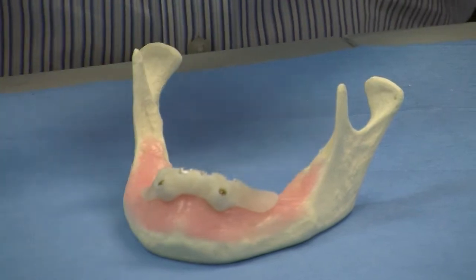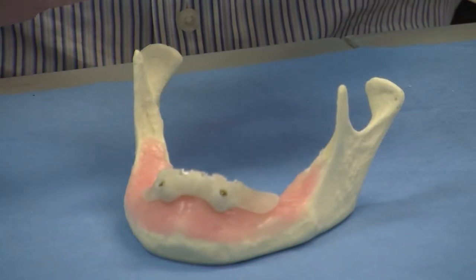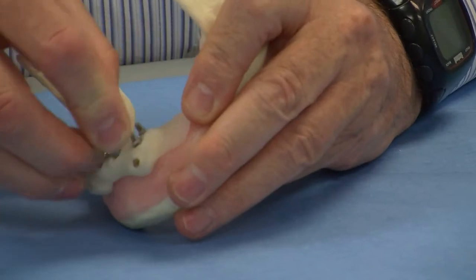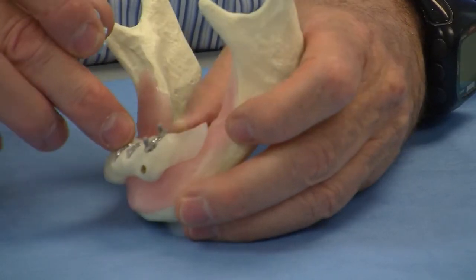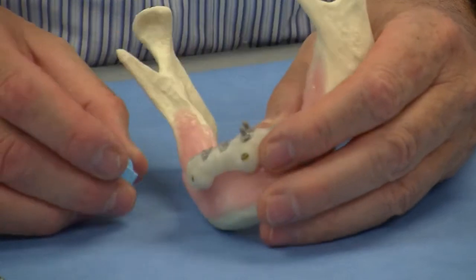To do that, we will insert one guide. So we have two ways to proceed. First one is to do one osteotomy at a time, or we can do all together by having 4 different guides.